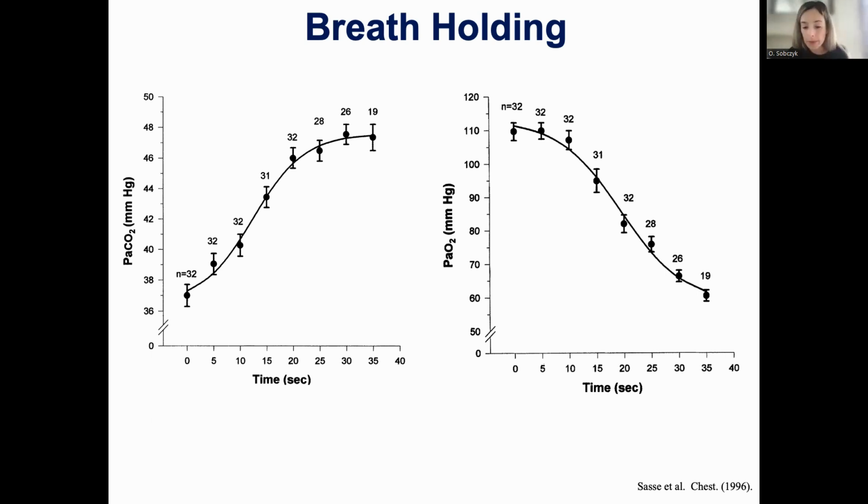The CVR repeatability obtained using breath hold is okay. I've seen in normals that the variability in the repeatability can range from 20 to 30%. But I've also read over recent years about analysis methods which improve the reliability and validity of breath hold CVR.